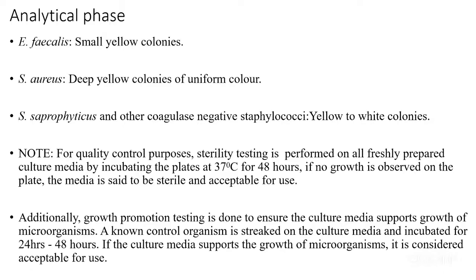Also note, when running all these procedures, from the dipstick to culture, you have to do your quality control. Ensure you have checked the acceptability for your strips. Make sure your strips are good fit for use. Do your quality control as you have documented in your SOPs. Then when you are doing the cultures, make sure your cultures have passed the quality control.